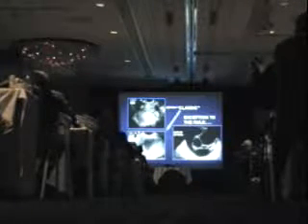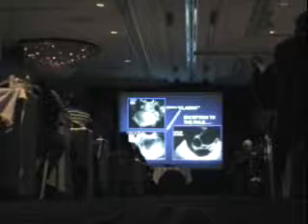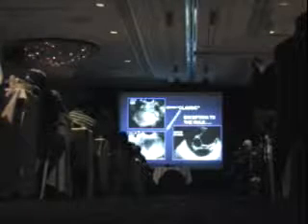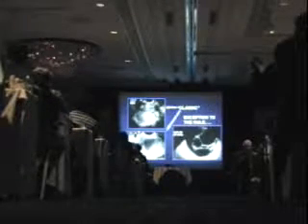But here I can see follicles. Here I can see follicles, obviously at fluid debris level, so I'm not really worried about that. That one I would worry about yesterday, today, tomorrow, because I was worried. She went to surgery, and the pathologist, who never is wrong, it's only after the fact of surgery, assured me that was an endometrioma, but that is clearly the exception.